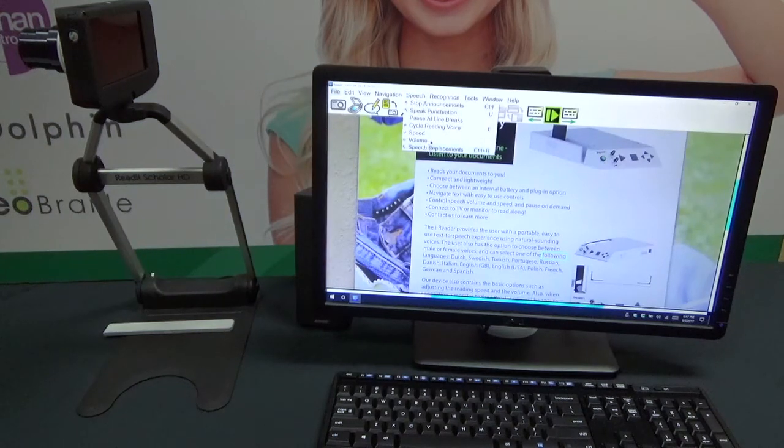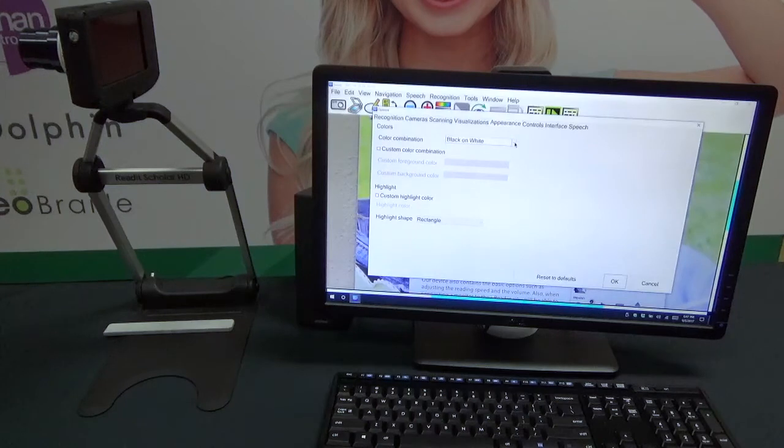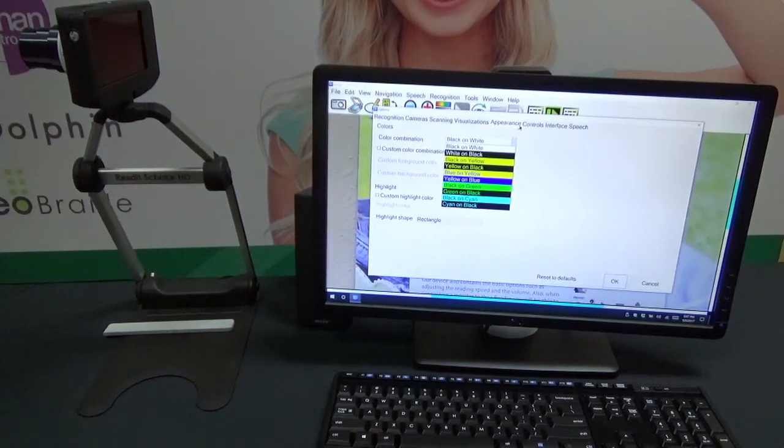That is distance view scanning. Additionally, we can go up here and control everything about our speech — our announcement, punctuation, volume, read speed, and change our voice. We can also go into Tools, go to Options. Under Appearance, we can change our high contrast mode. Right now I have it on black on white, but we could also do white on black, yellow on black, black on yellow, blue on yellow, yellow on blue, green on black, black on green, black on cyan, or cyan on black. We have a whole slew of different high contrast modes besides the default.